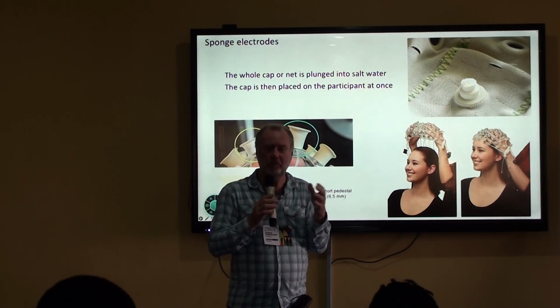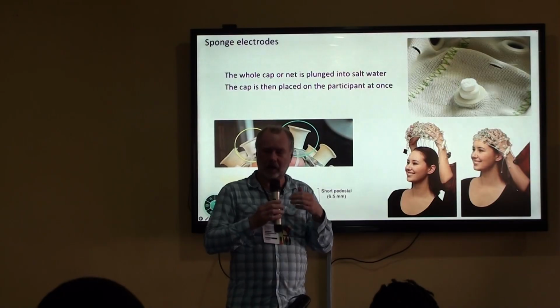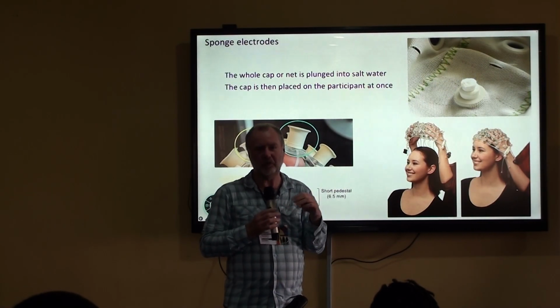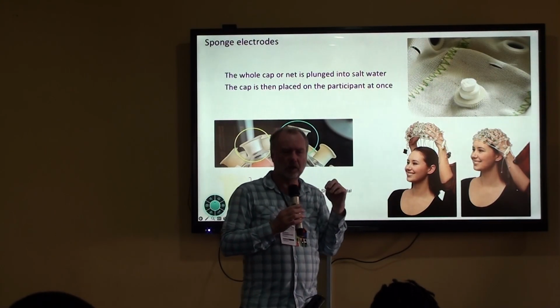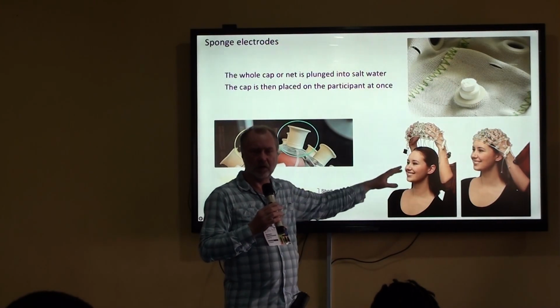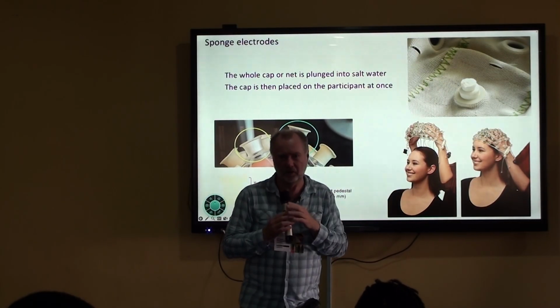And especially I would be afraid that she would be using too much salt water, because if you say salt water, let's overdo it. And if you use too much salt water, the signal quality is going to go down because you're short-circuiting all the electrodes. So as such, for this system, although it can be applied faster, I think by applying this system by untrained people, it's going to be less robust.